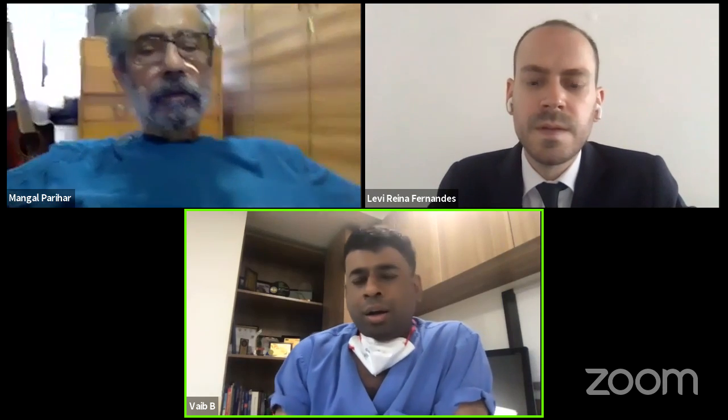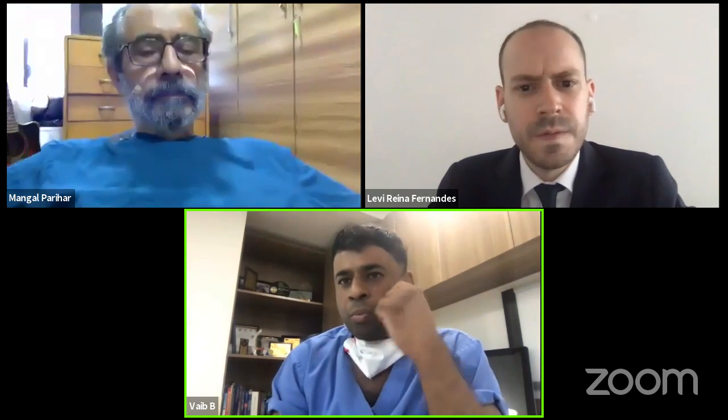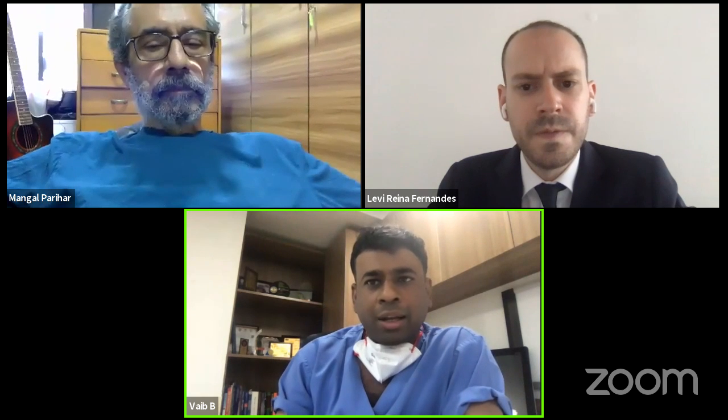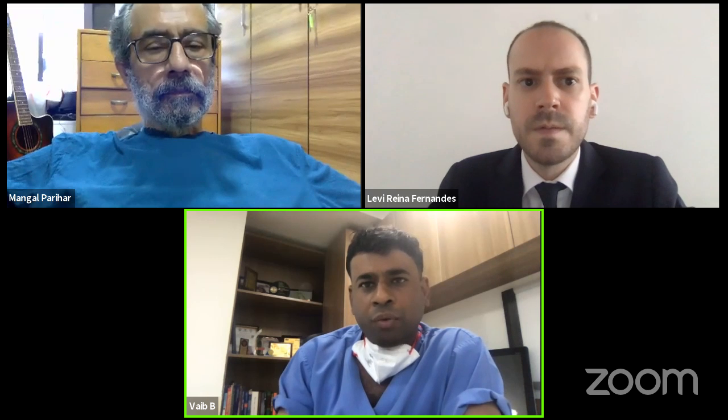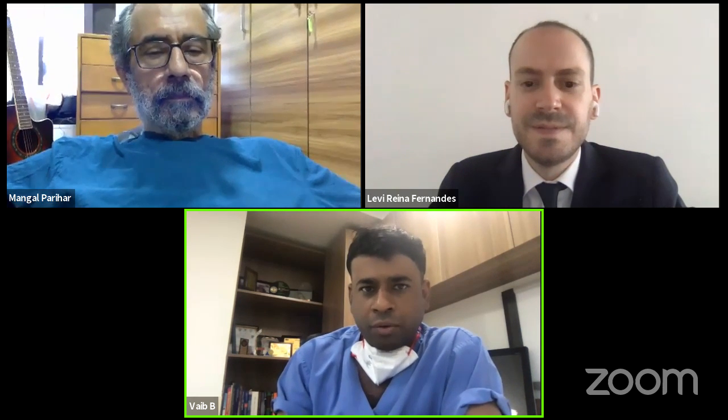So could these planning software export data to create mechanical jigs? Can we export the data to get some meaningful information to print 3D jigs for doing osteotomies? Or I'll let Joan answer this question as well.